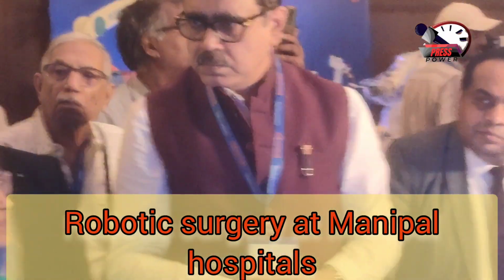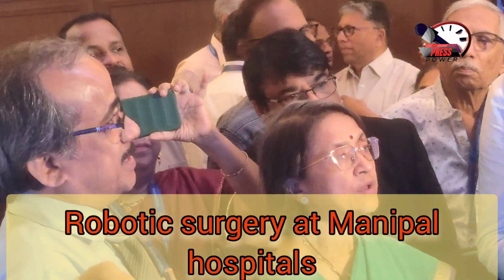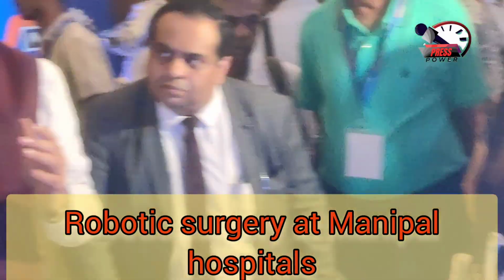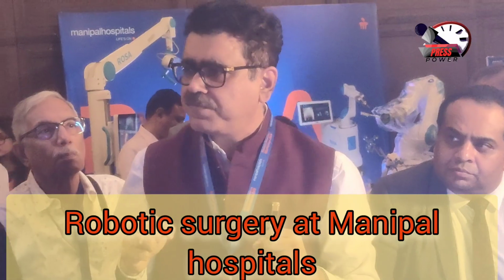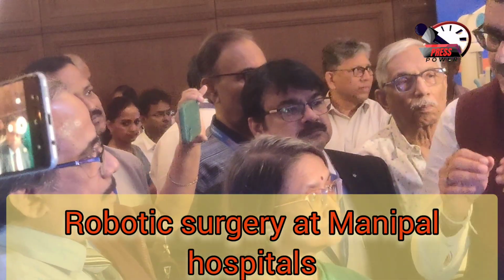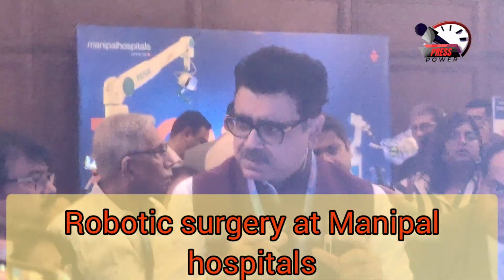Resolution means, what is the least count? The least count of the resolution on which the precision depends. I mean, minimum how much can you see? How many millimeters, is it zero? We can go up to, very rarely we will have less than 1, because it is not desirable, sir. It becomes very stiff. It is very near to zero, but not zero. We should not make it 0 because it becomes very stiff. We should leave it at 1 to 2 millimeters, which is the ideal optimum. It can go up to 3 millimeters to keep it nice and mobile and flexible, because ligaments need certain flexibility in a range.